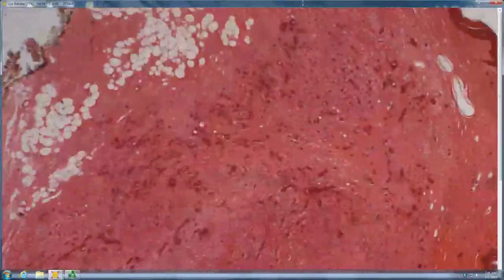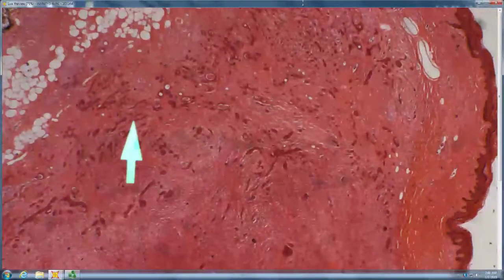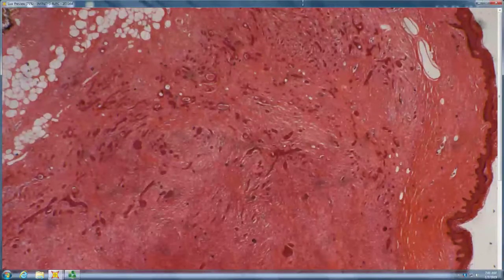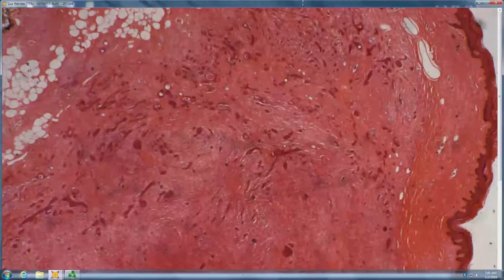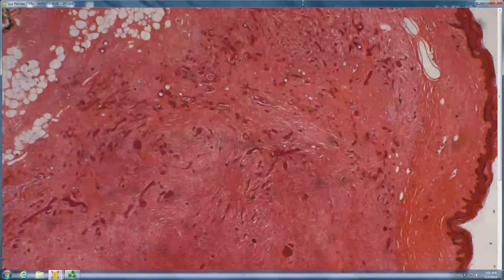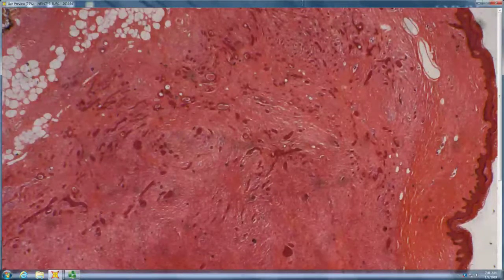I think this is neurofibroma. Neurofibroma, without capsule. And then what's all of this stuff? Sweat gland. Looks syringomatous. So there are syringomatous schwannomas and syringomatous neurofibromas, and they're benign. But you get this crazy proliferation of what looks like syringoma all through the neural tumor. They're rare, but they are totally benign. Have to be distinguished from Triton tumors.